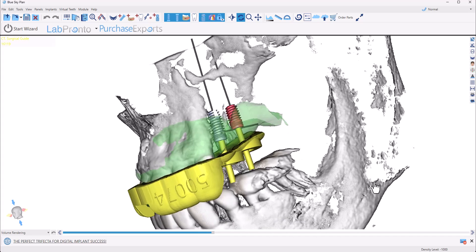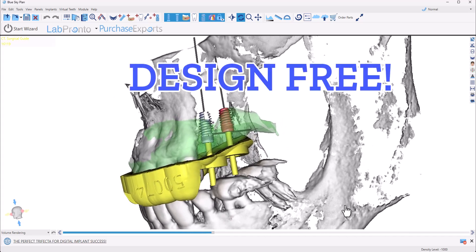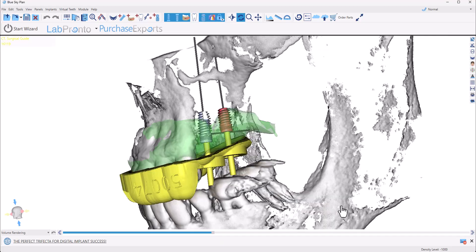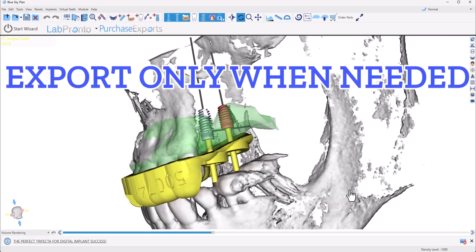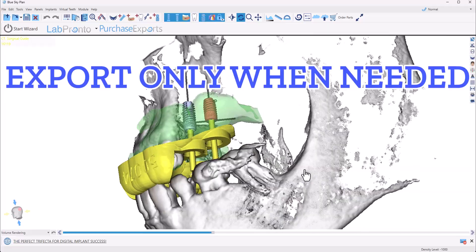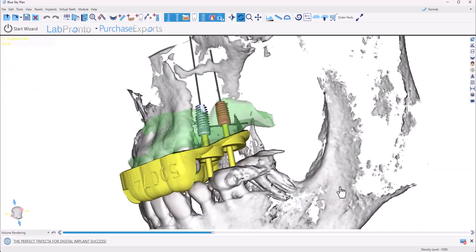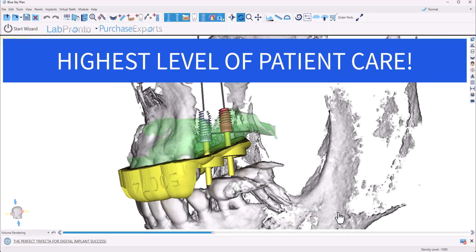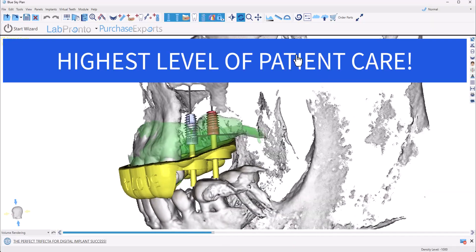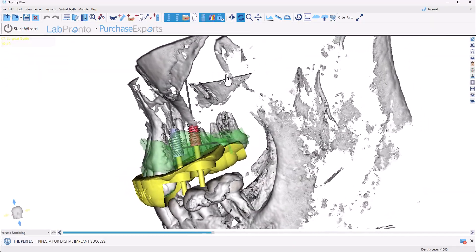Best of all, the entire design process is completely free. You only pay when you're ready to manufacture, with export fees starting at around $17 per case. By using a surgical guide, you ensure the highest level of patient care while increasing predictability and significantly reducing chair time.